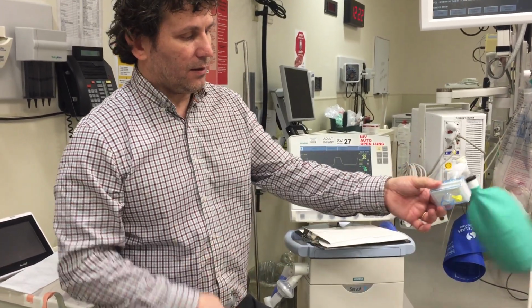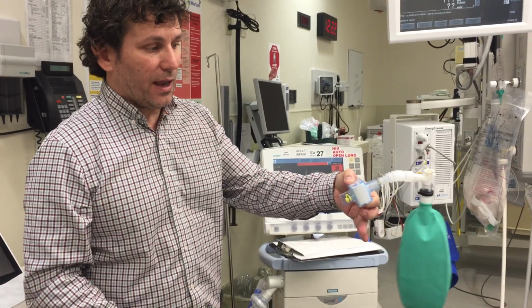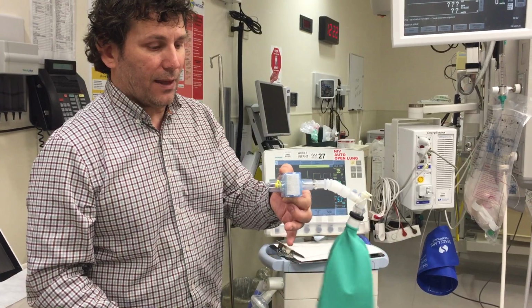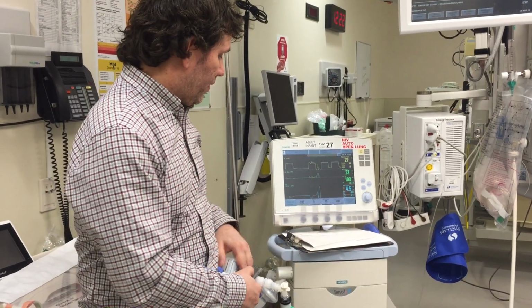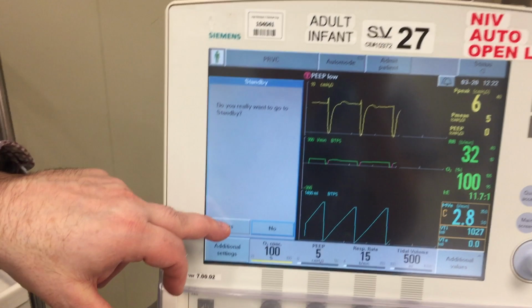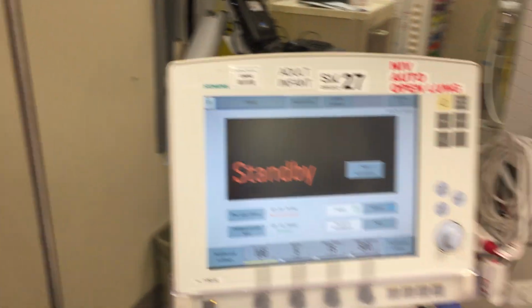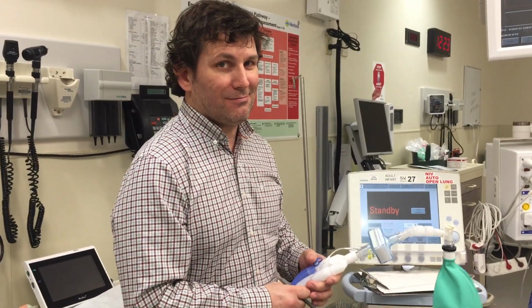So we would take them off the vent and connect our bag here, so the patient is never breathing out to ambient air. So we would always have that. All right, so the bag would connect there. And at that point, we'll just reach over to the vent and hit the button again. And then it asks, do you really want to go into standby? Yes. And that turns the vent off. And that is how we ventilate somebody in emerge. All good? Yeah. Okay.